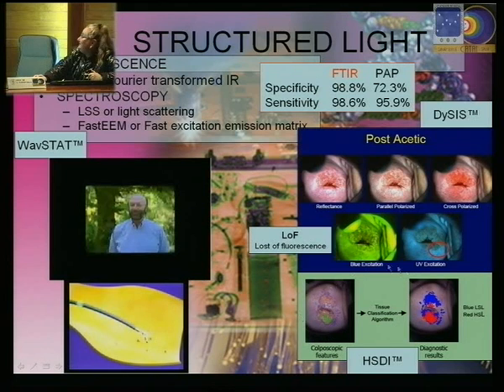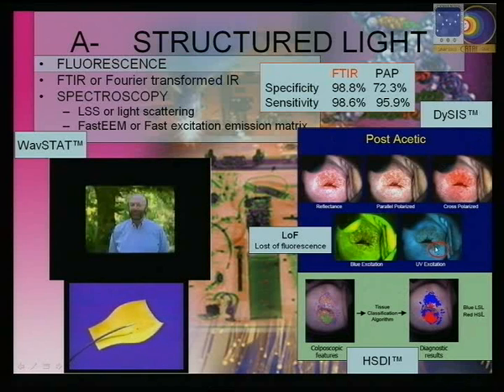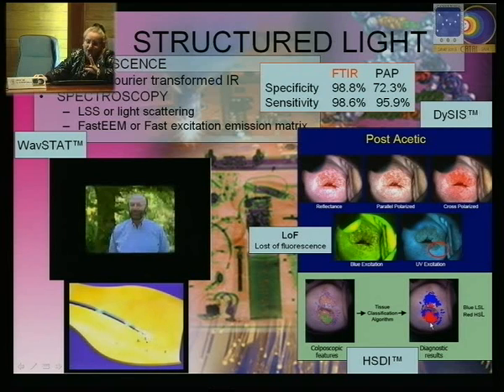Also, there are some intelligent systems, intelligent in that it is difficult to trust them unless you know exactly how they work, in which combining all these technologies, they select not visually as you have seen in here, but electronically, the area of interest that you need to biopsy according to some strange, let's say, parameters which are inside the device.